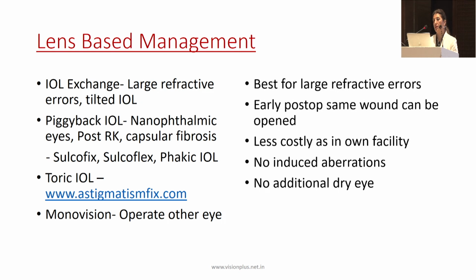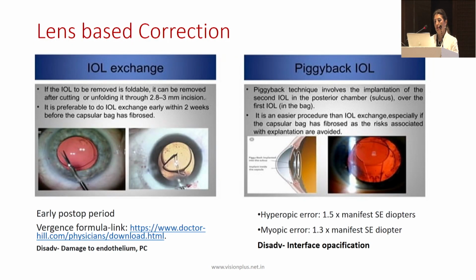And in the early post-op period, the same wound can be used. It's less costly as you're doing it in your own facility. And there are no induced aberrations, no additional dry eye. So for IOL exchange, there are different options available. You can use these IOL cutting scissors.